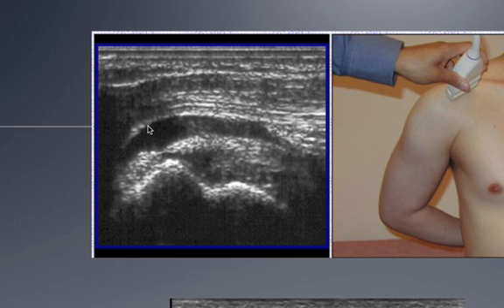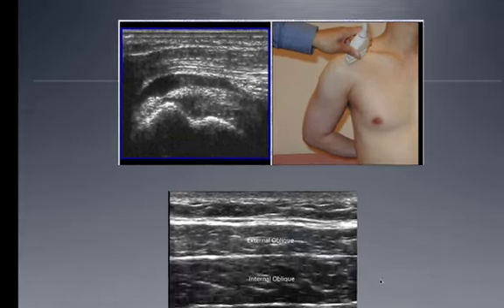That dark black. Okay, looking down below at this picture, here's our picture of the transverse abdominis, internal oblique, and external oblique. So a good view of what muscle is going to look like. Again, that Starry Night or filet mignon sort of look when we look at muscle.